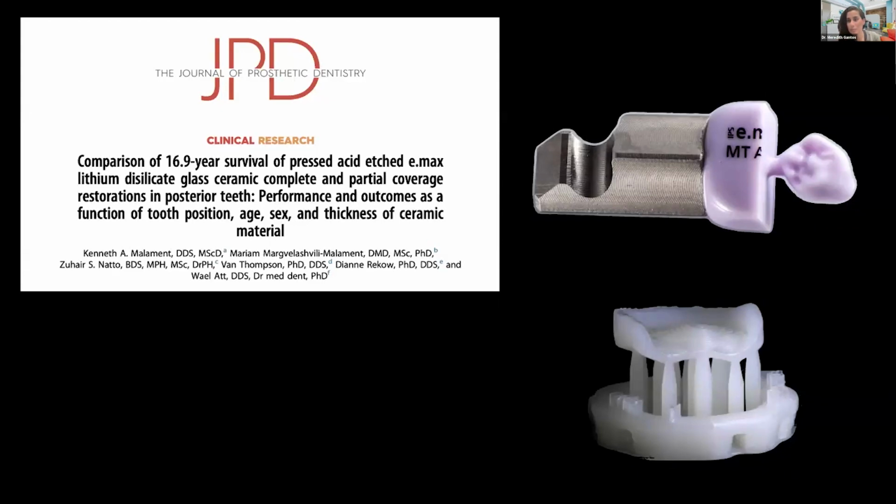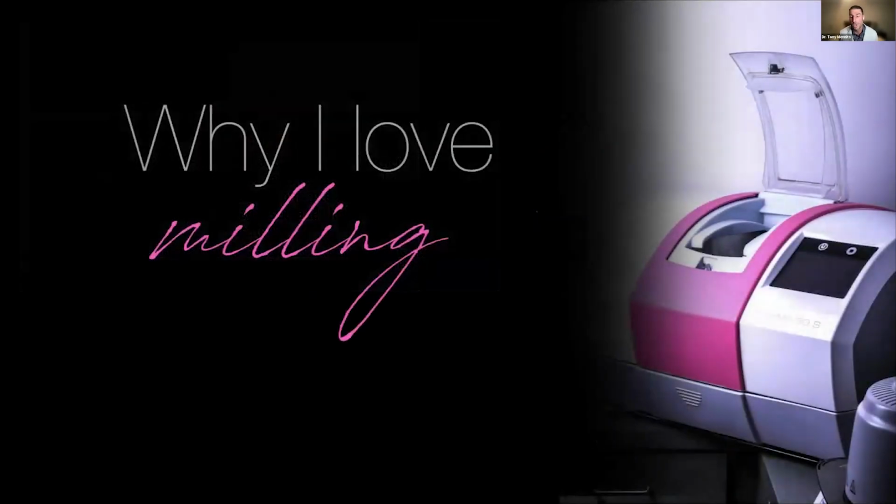Absolutely. I actually have a case that I'll show where I used a few of those materials. That's a great question though, because you're right. If we're talking about comparing apples to apples, are we really comparing apples to apples when it comes to Emax versus these printed materials? I think there can be some confusion there because they are being characterized as ceramics, even though we know they're really closer to resin than they are to ceramics. A lot of the marketing, I think, has caused some confusion in people's minds. So this is just an opportunity for us to set it straight.